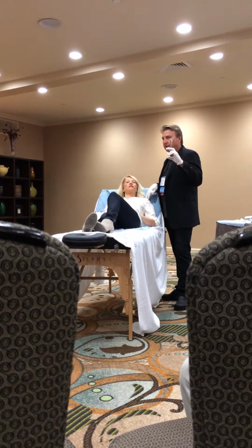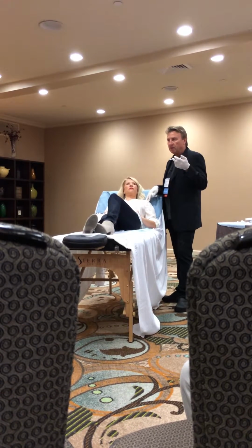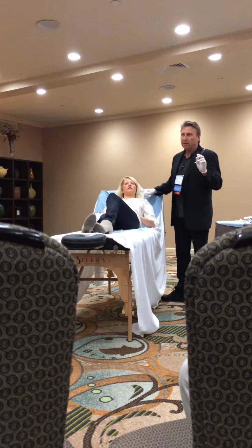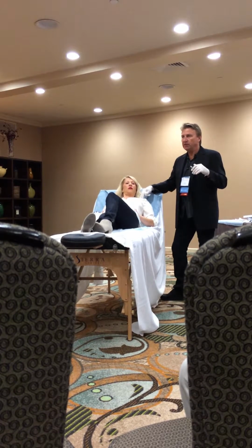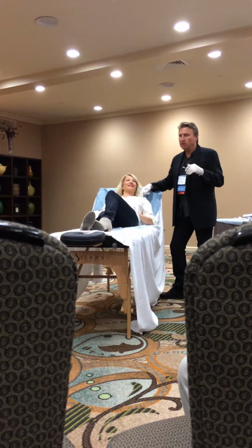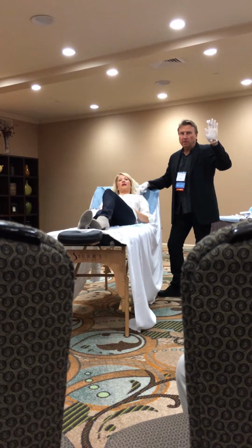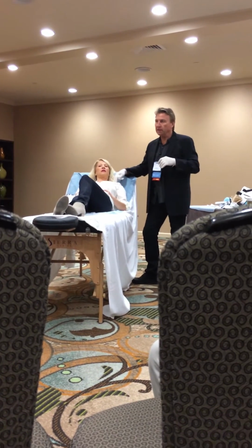Sometimes what we'll do is I'll transfer some of this to a 1 cc syringe before I start, and we'll tag that with the name, and then we have a special place we put it for patients so they can come back later for a touch-up, and I don't charge them anything additional. Probably not the best policy in the world. Do other people do that too? I give it to the patient. But I won't charge. Try it. That's good too, so you don't have any issues with that.